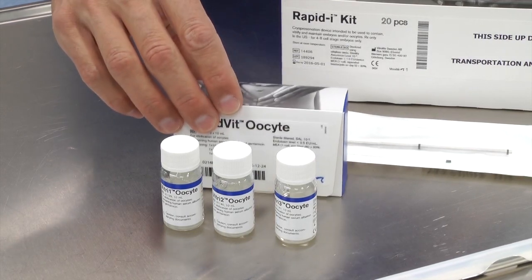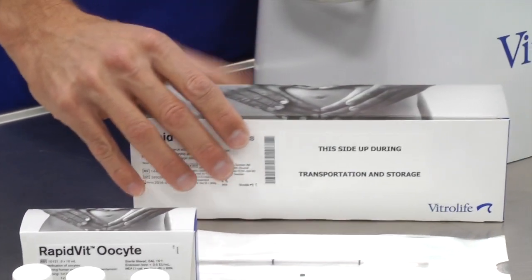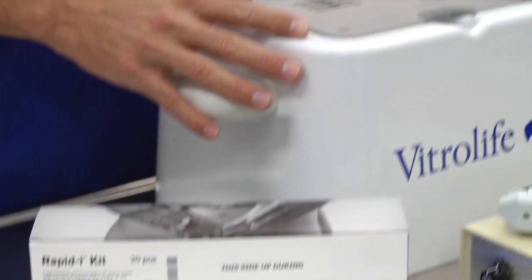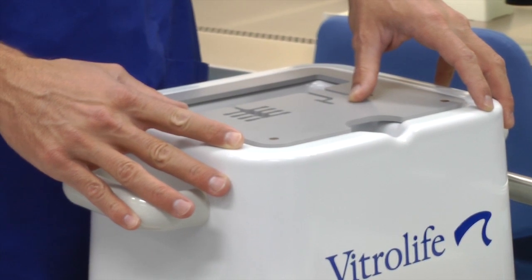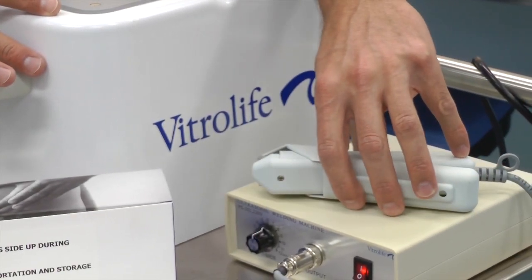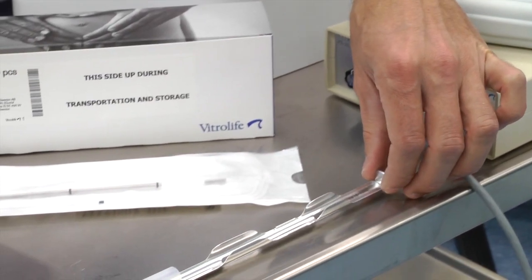For oocyte vitrification, you will need the oocyte vitrification kit, which consists of three solutions, the RapidEye straw and device to load the oocytes on. You will need the smart box in which the straw will be contained during the procedure, containing the liquid nitrogen, as well as the ultrasonic sealer to seal the straw afterwards. The straw will then be placed in a cane, which will be part of your storage device.